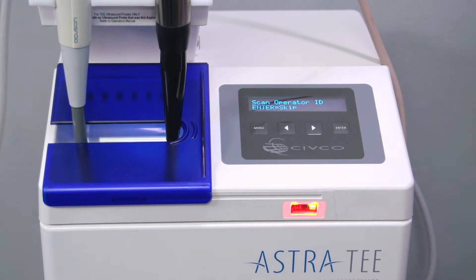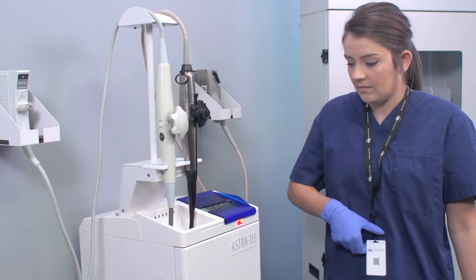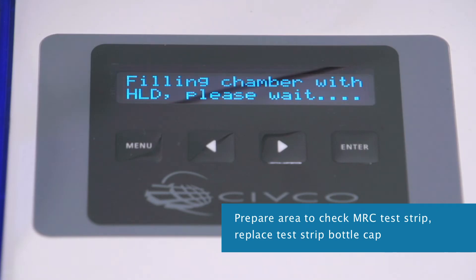Do not try to add a second probe once the door is closed. Closing the door turns on the scanner and the display reads 'Scan Operator ID' — press Enter to skip. While the disinfectant is pumping up, place a paper towel with an MRC test strip beside the unit and replace the test strip bottle cap.